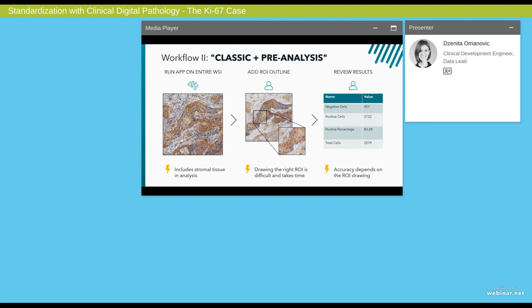Now, in the second workflow, the image analysis is run on the whole slide, and the pathologist afterwards confines the results to the relevant regions and makes the image analysis fit the purpose. So again, quite a lot of manual interaction is necessary, and this is, for example, to ensure that stromal cells are not counted. This costs time and might also lack in reproducibility and standardization.